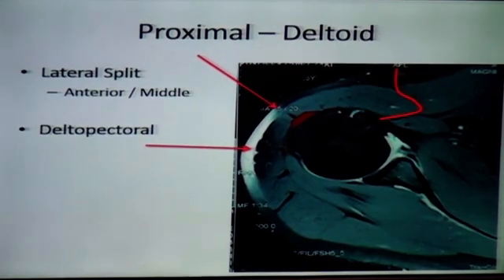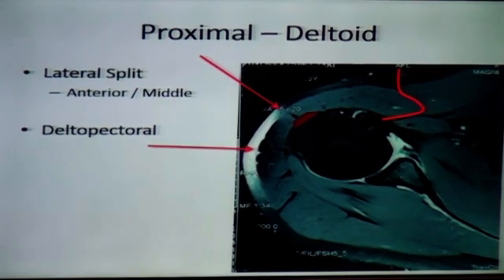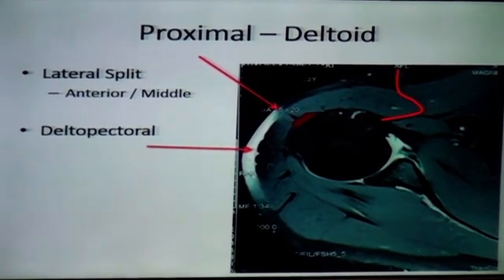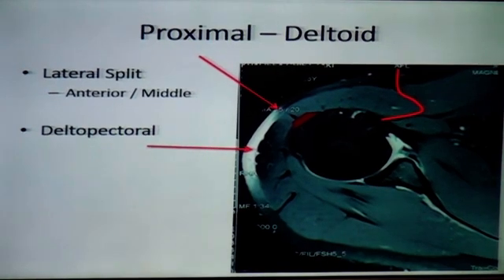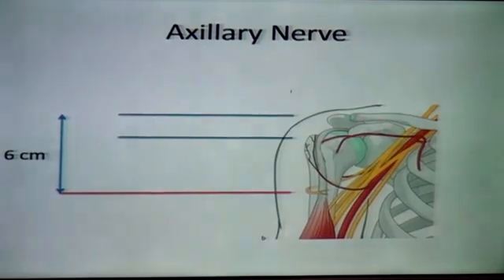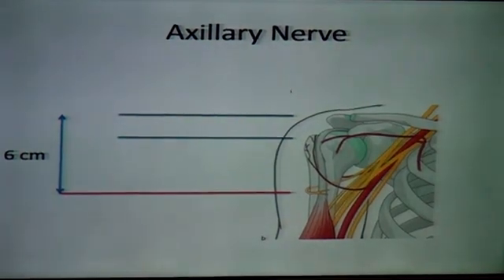If you go slightly anterior, you might find some resistance at the deltoid insertion. Being slightly posterior through the middle part, you don't have that much problem — the plate slides backwards and downwards easily. The axillary nerve is about six centimeters down, and we will expose it.